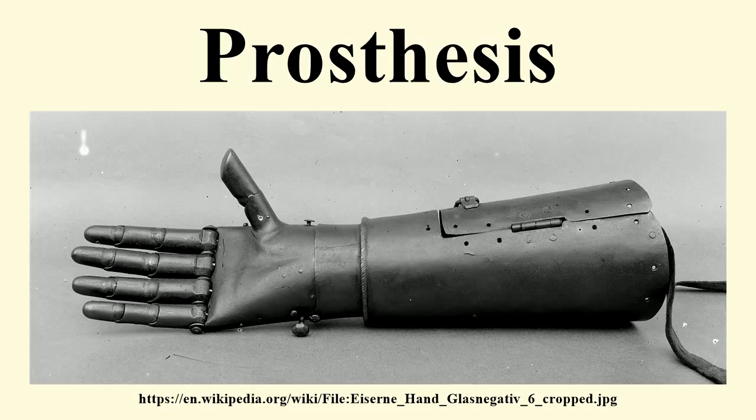Lower extremity modern history. Socket technology for lower extremity limbs saw a revolution of advancement during the 1980s when John Sabolich, CPO, invented the contour-adducted trochanteric-controlled alignment method socket, later to evolve into the Sabolich socket. He followed the direction of Ivan Long and Oscar Christensen as they developed alternatives to the quadrilateral socket, which in turn followed the open-ended plug socket, created from wood.